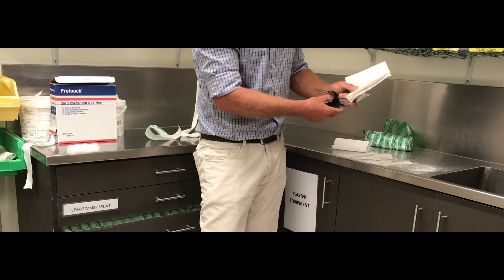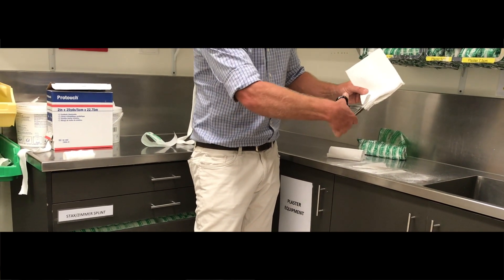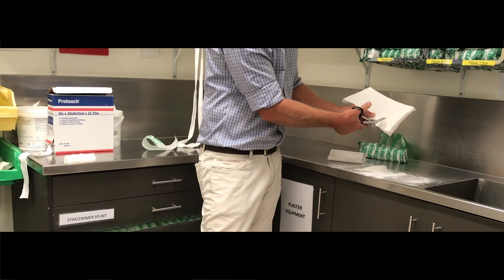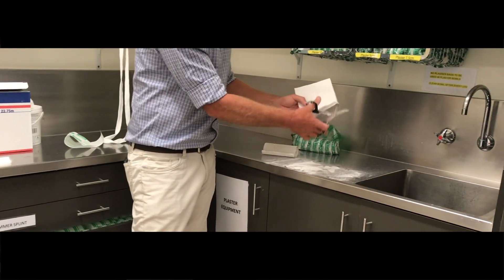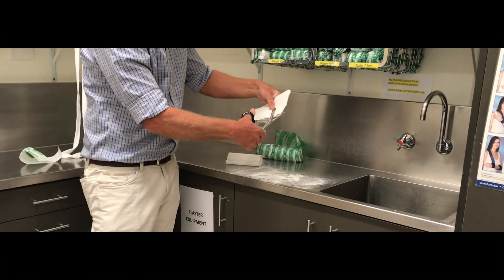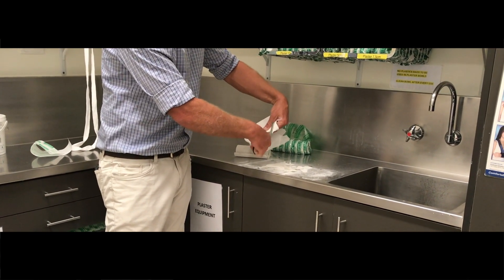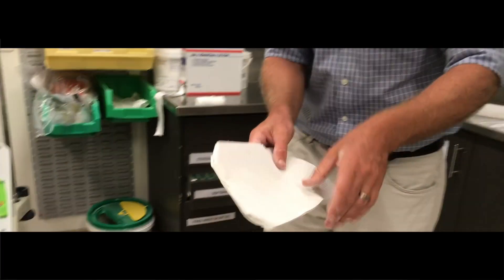And then they still want to be able to use their thumb. So come in about an inch here and then just cut a chunk out about that sort of size for your thumb. And then I just cut off the corners of each end so that they don't dig in. And that's your Colles' plaster.